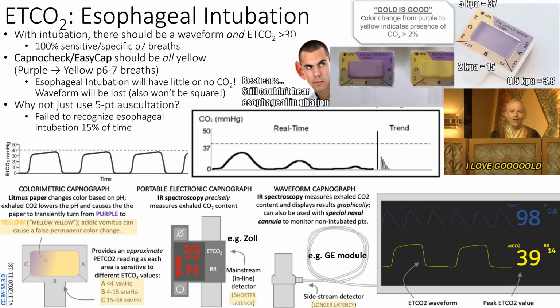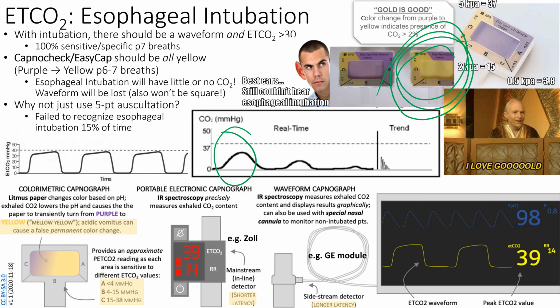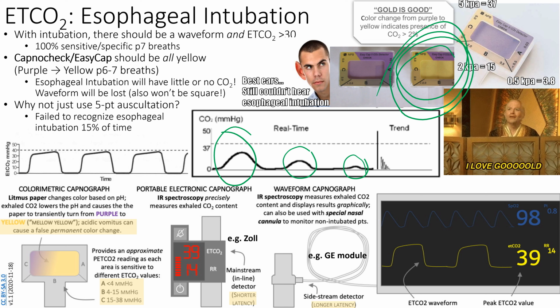All right, so the different reasons for end-tidal CO2. We've kind of talked about this, but let me explain it in a little more detail. The esophagus being intubated, right? If you intubate the esophagus, you're going to see your waveform start to go down, right? So you might get a little capnostat reading right there. So, oh, I'm in the right place. But then once you hook it up to the monitor, you're going to see 1 breath, 2 breaths, 3 breaths. Definitely by 6 to 8 breaths, you're not going to have any more CO2.